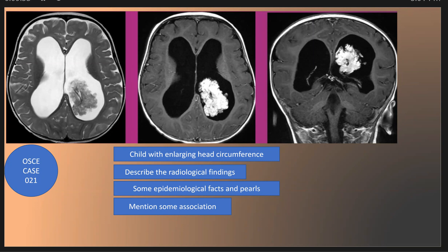As we see here in this patient, we have T2 and T1 after contrast axial cuts, and coronal cuts T1 after contrast. In T2, we have a lobular frond-like mass in the atrium of the lateral ventricle. This mass also has internal flow voids due to vascular pedicle, and there is avid enhancement of the mass after IV contrast, as we see here.